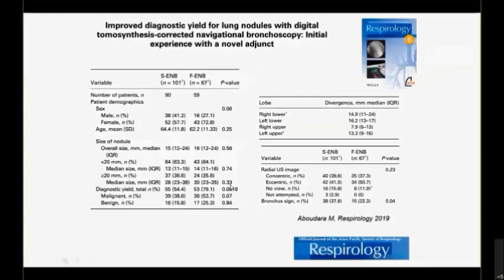Now, what we talked about here is the diagnostic yield, and really we're talking about the diagnostic adequacy of the sample. Did we have on the biopsy evidence of cancer or something else that could, in a compelling way, explain the presence of a nodule there? In other words, we find granulomatous inflammation or pus or something like a hamartoma, something that's obviously diagnostic. And I'm not talking about follow-up here, just what we got that day on the biopsy.